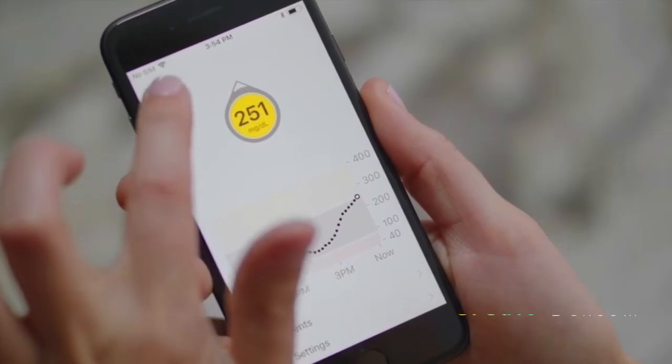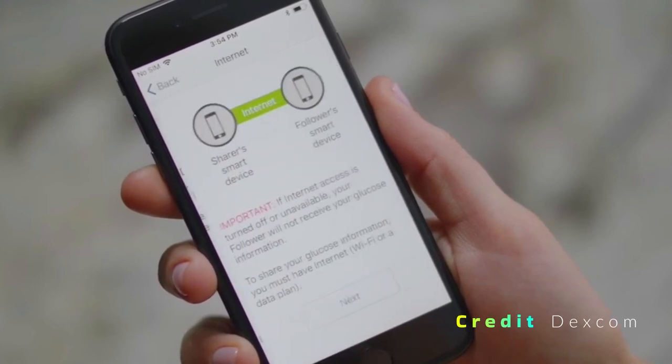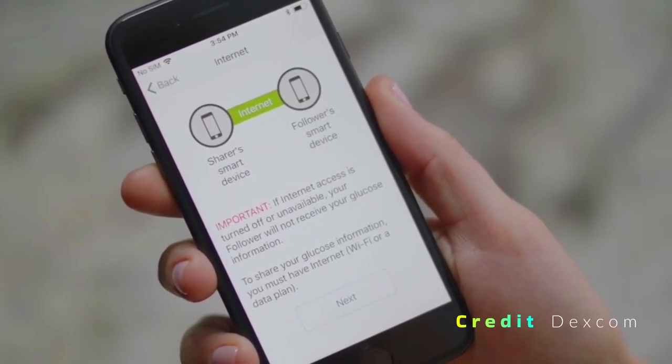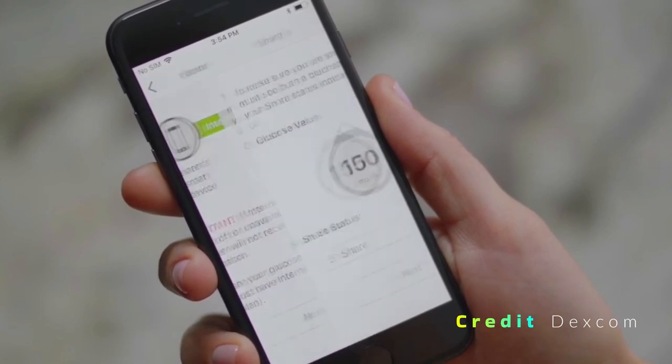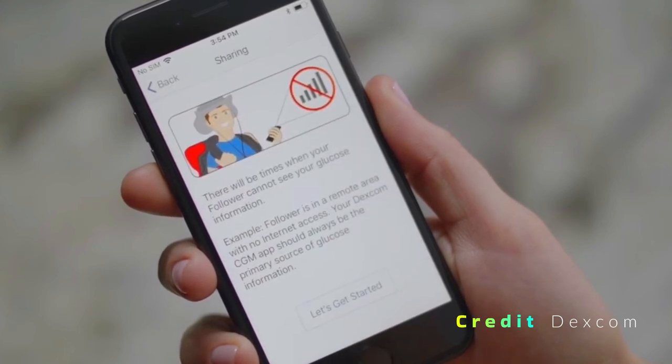Before we begin, there are a few things you need to know. This watch face works with the Dexcom G6 CGM system and requires you to set up the Dexcom Share app. After you've installed the Dexcom Share app on your phone, follow the setup and remember your login credentials. If you don't remember your Dexcom credentials, they're the same ones you used to sign up for Clarity on the Dexcom website. You'll need them to connect your Bolse watch face to your CGM readings.